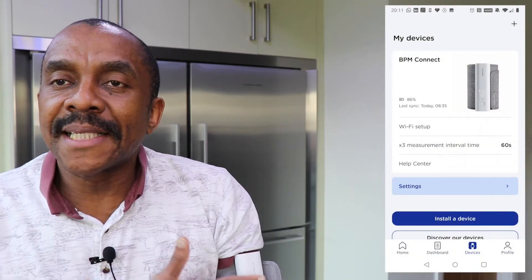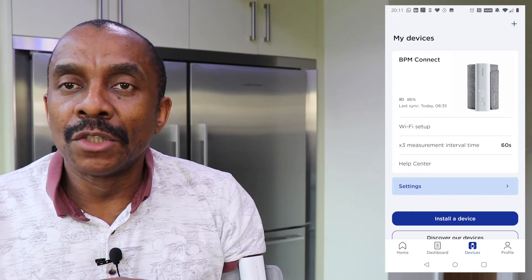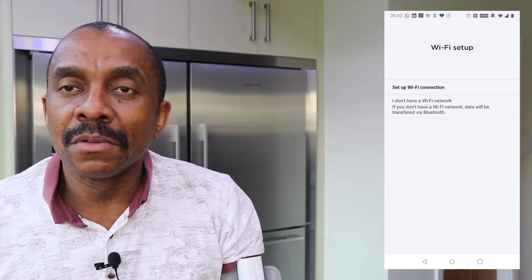I think that maybe 30 seconds to a minute is reasonable — anything more than that, personally I wouldn't be patient enough to wait. So you have that option on the app if you want to take advantage of that feature. You can also sync the blood pressure monitor with the app either using your Wi-Fi connection or using Bluetooth.